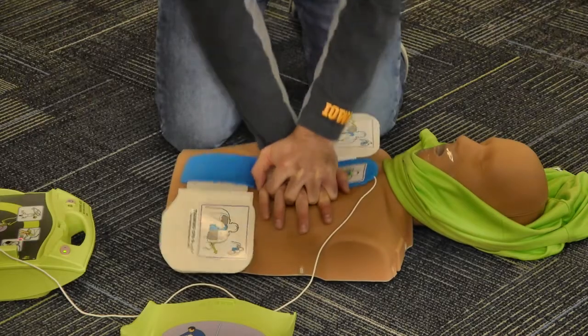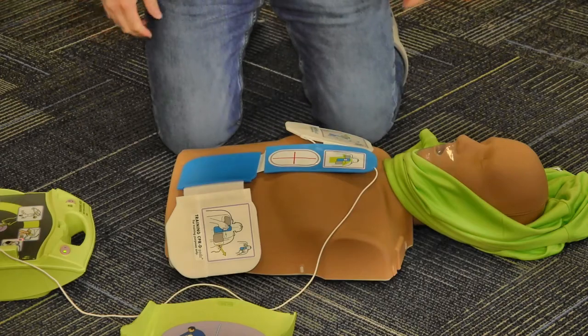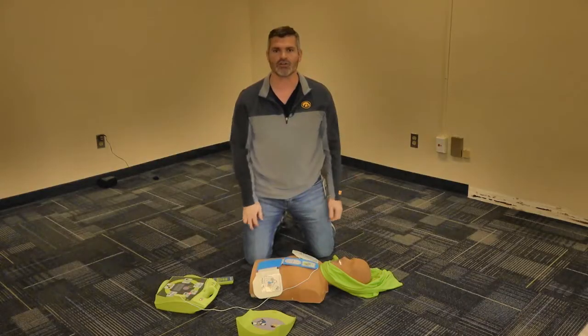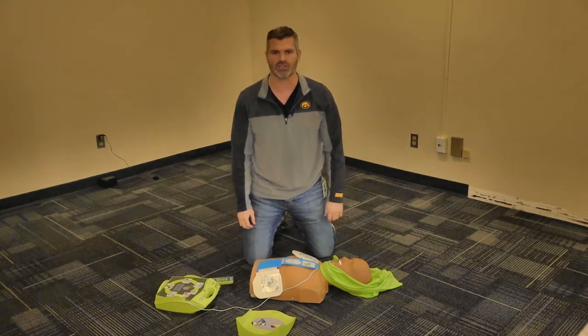Start CPR. We're going to start with compressions right after the shock is delivered. We're going to follow the beeping of the AED — that's 100 to 120 compression beats per minute — and that's what you want to do per American Heart Association guidelines.